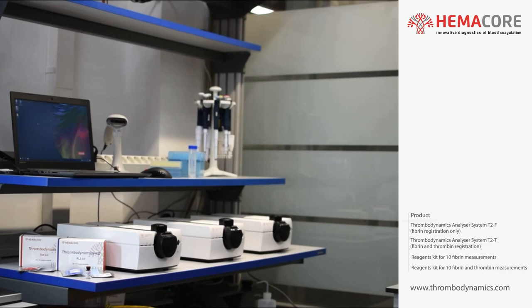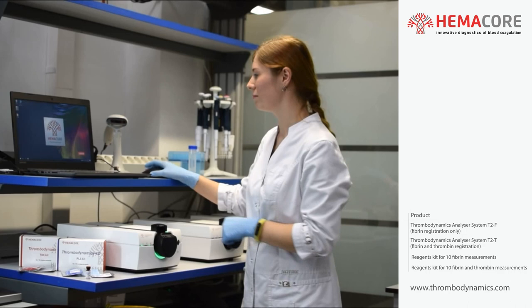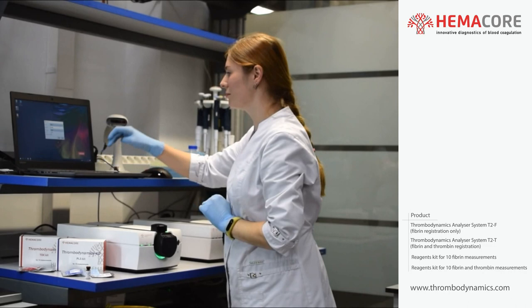This is how to run measurements on the Thrombodynamics Analyzer System, model T2T. Turn on the analyzer with the main switch on the back of the device. Turn on the computer and run the Thrombodynamics 4D software. Log in to the software with your credentials.